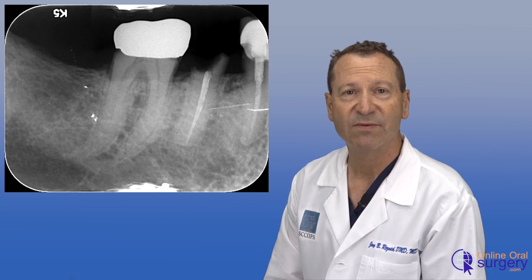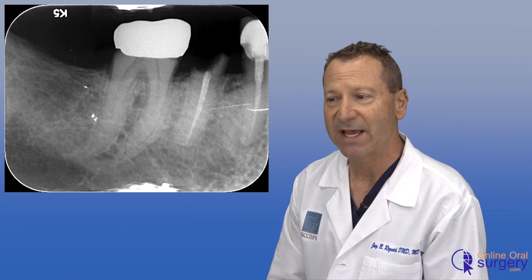A lot of techniques have been developed over the years, including atraumatic instruments such as approximators, periotomes, and luxators, in an attempt to remove teeth as atraumatically as possible. These techniques work pretty well, but sometimes we would have a tooth where no matter what hand instrument we used, we had to get out our surgical handpiece to facilitate removal. Traditionally, we take a 701 burr or a thin fissure burr and trough around the root to make more space between the root and the alveolar bone.